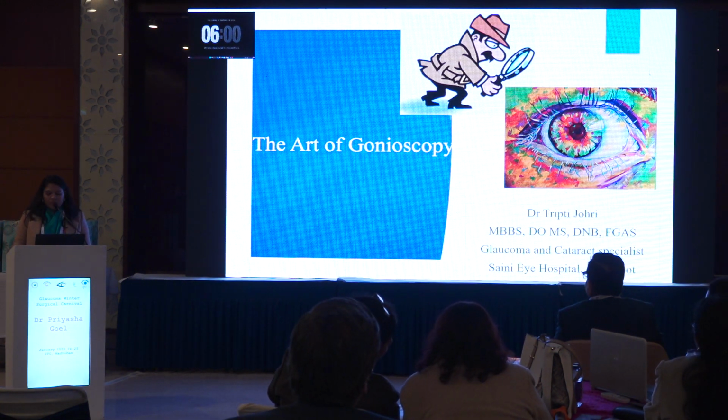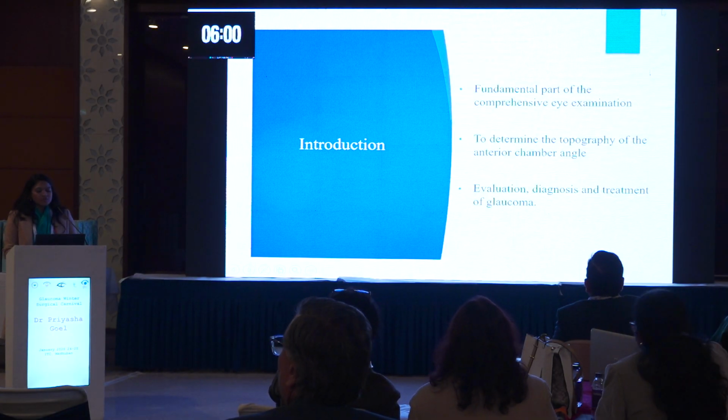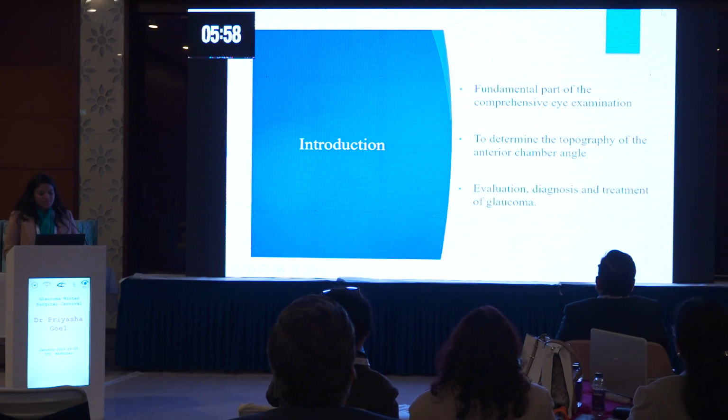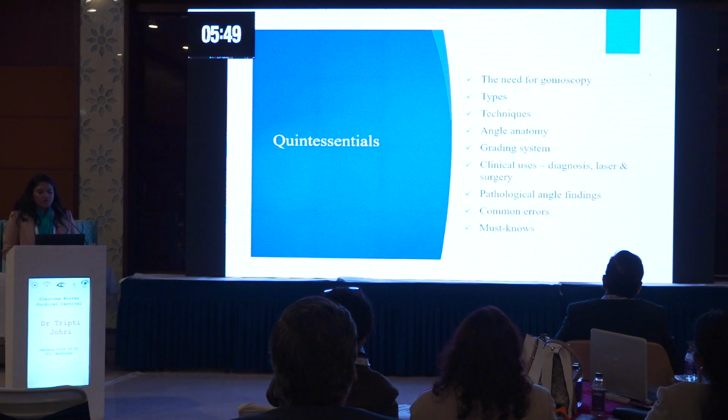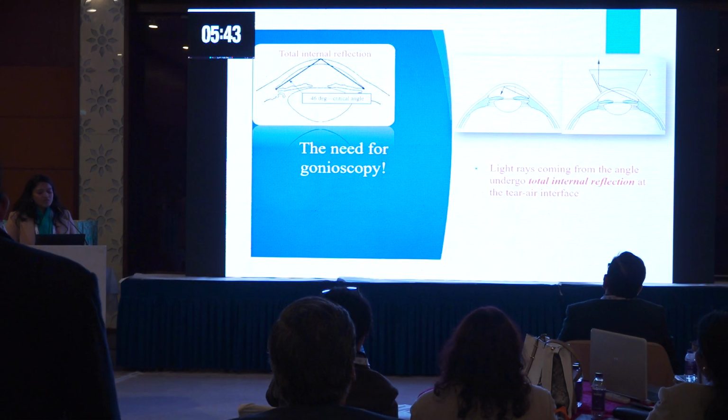Okay. So my topic of discussion is the art of gonioscopy. Gonioscopy is a fundamental part of comprehensive eye examination and it helps in determining the topography of the anterior chamber angle. It is helpful in evaluation, diagnosis and treatment of glaucoma. So these are the various topics which we'll cover in this presentation.